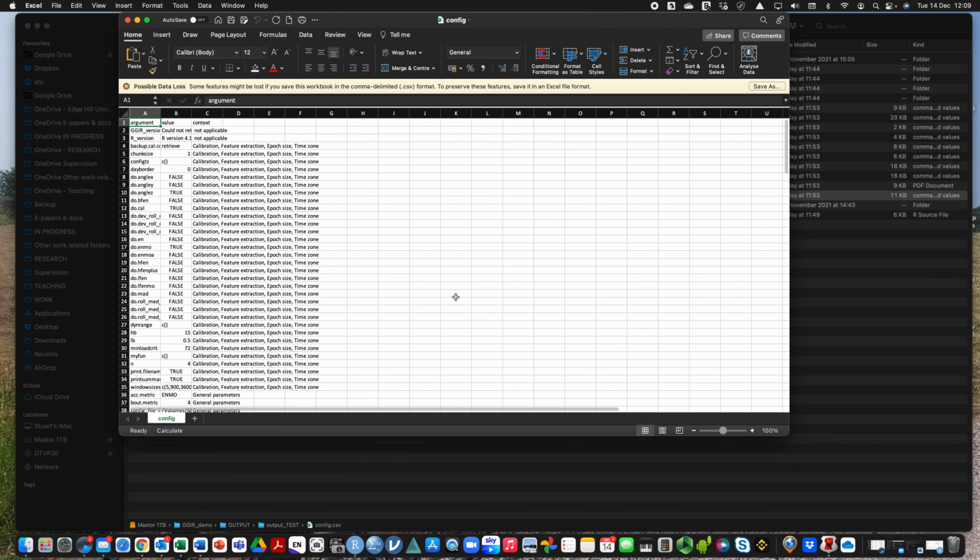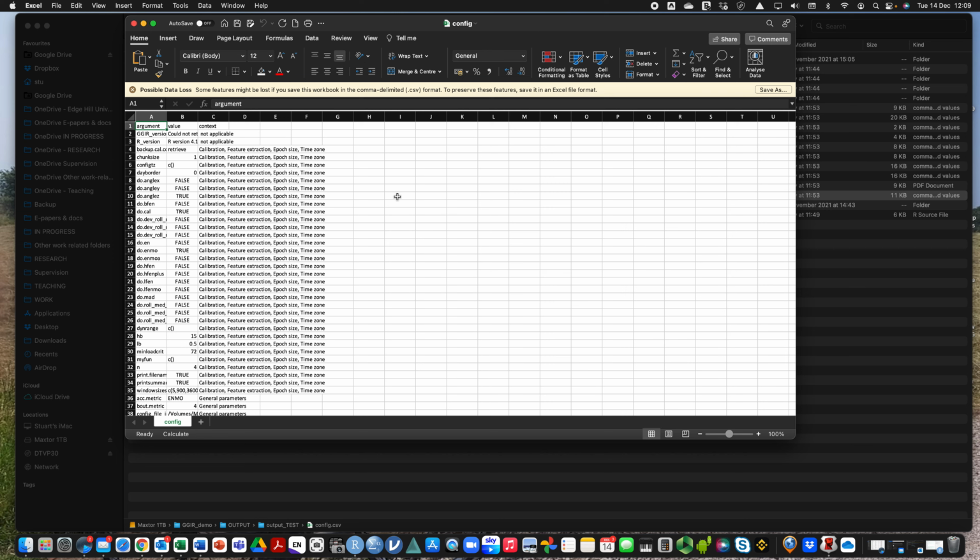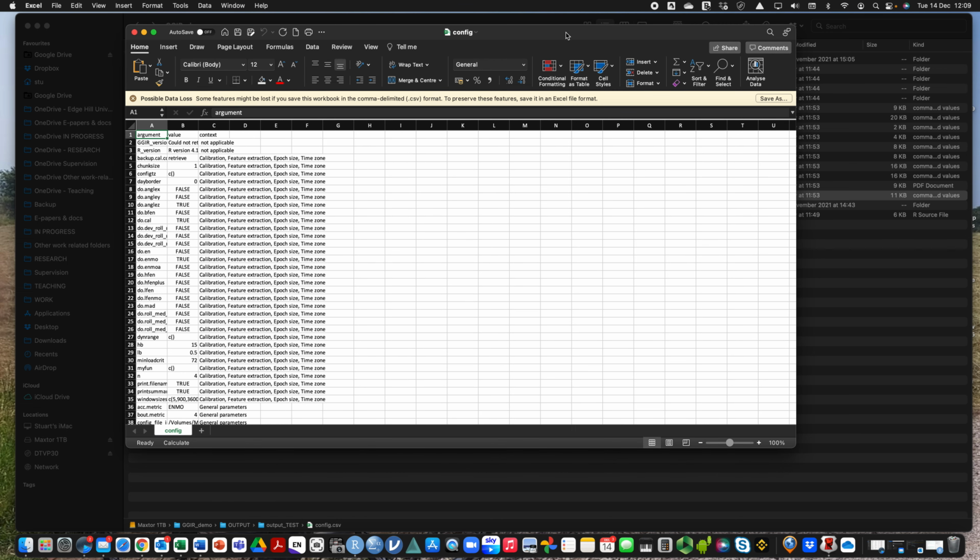So in terms of comparability and open data, always useful to make this file available in your publications, because others can directly replicate your processing in GGIR. So useful to know what that file is for and to keep it saved in a safe place for when you've done your final analysis ahead of publication.